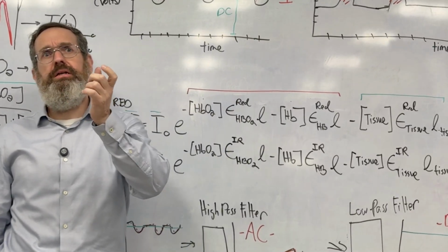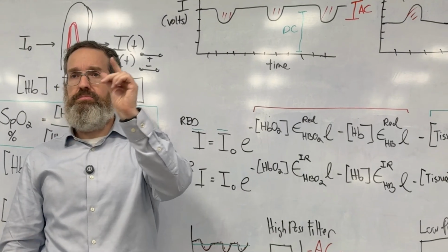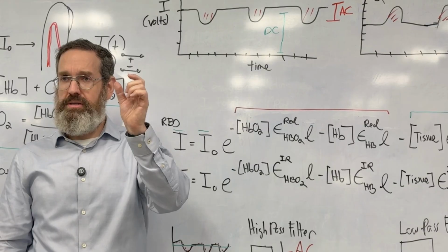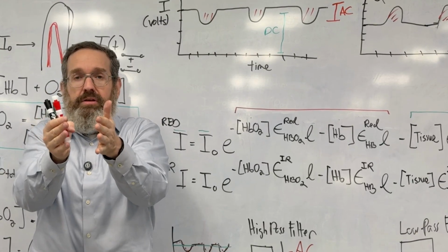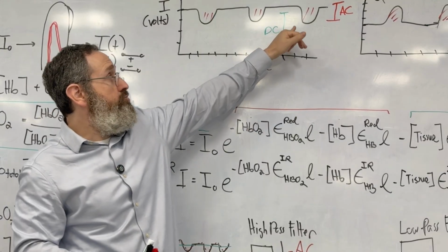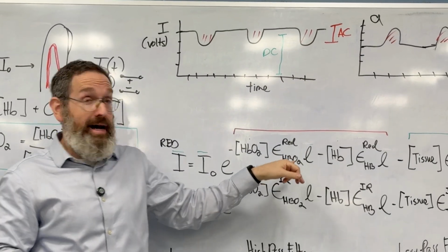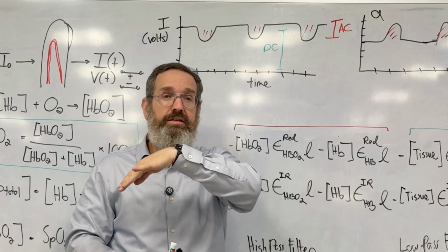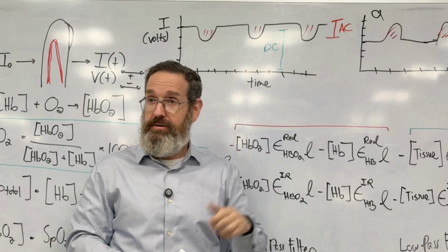L would be something like the amount that Emily's blood vessels, the capillaries in her finger, dilate every time her heart beats, right? There's an influx of blood, and so Emily's blood vessels swell a little bit. That's what's leading to this transient change here, right? There's a surge of blood going into her finger. I don't know what that is. I really don't know. I have no way of looking into Emily's finger and saying 100.3 microns, right?